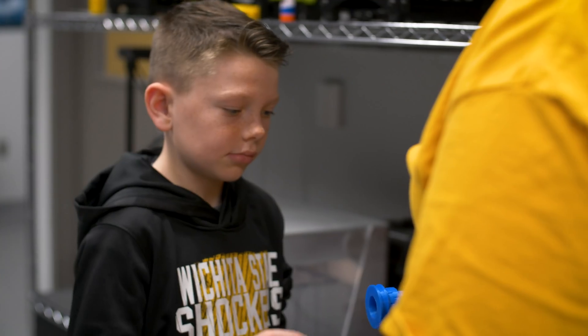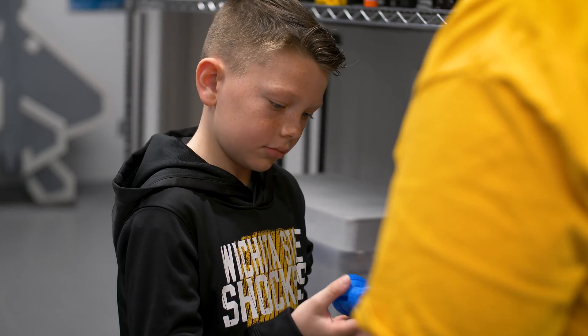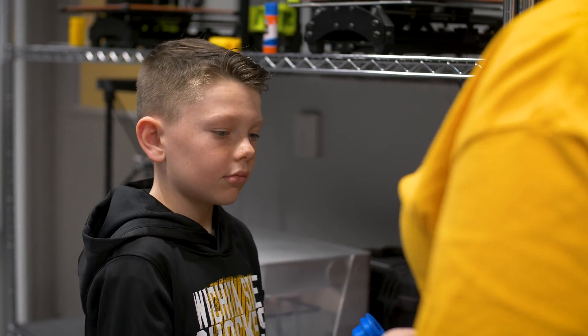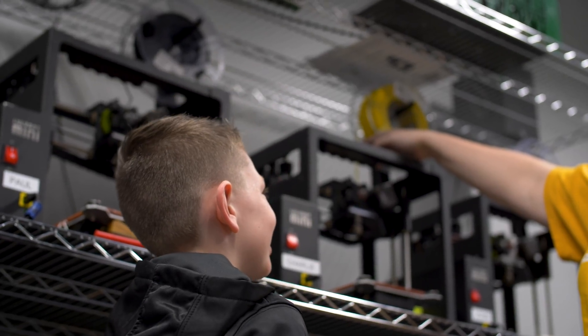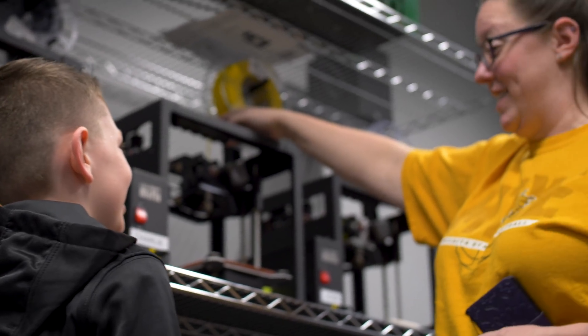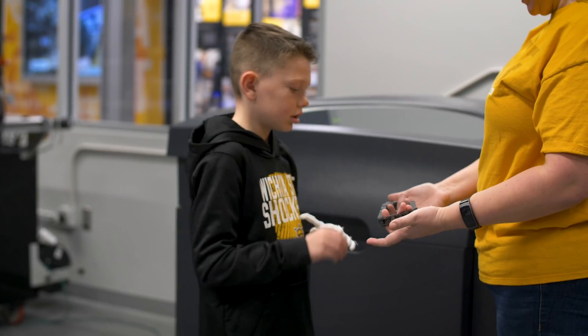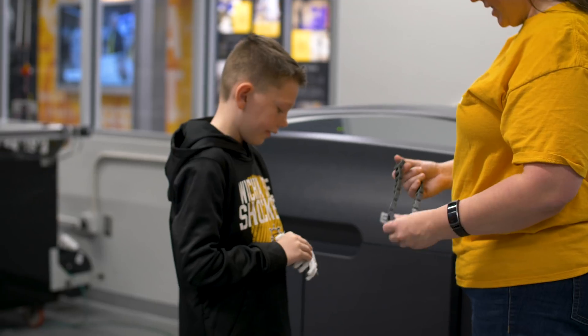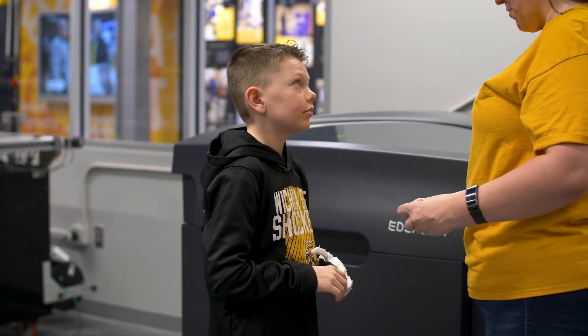Talking to Chase, I knew that he was definitely a bright young boy and I knew that he wasn't going to let anything slow him down, hand or not. So what I hoped was that we could get him a robotic hand — it would make him the cool one in the classroom, and maybe have a killer Halloween costume. Personally, I was hoping he'd be willing to work with me on future versions that would be a little bit more useful to him, and maybe even specialize it, because I know he's a pretty active kid as well.